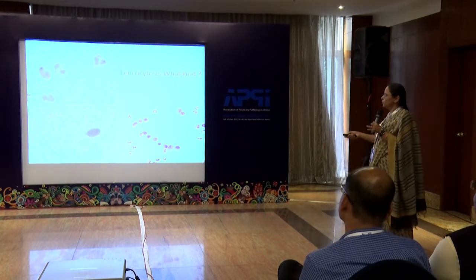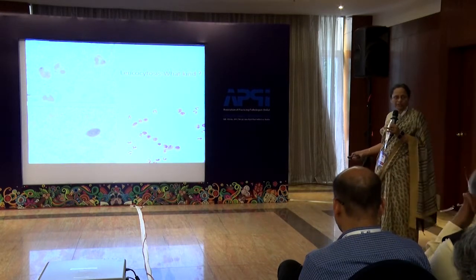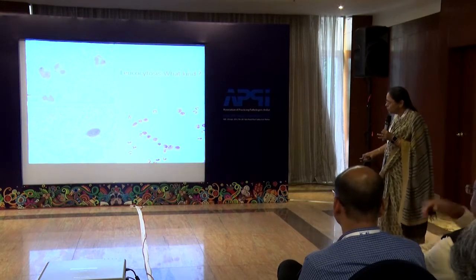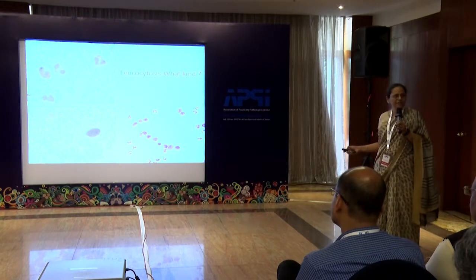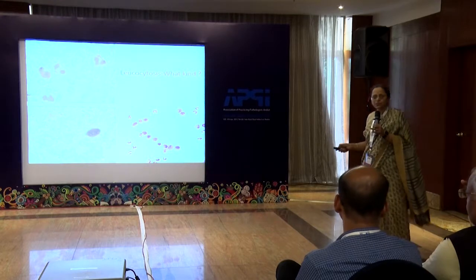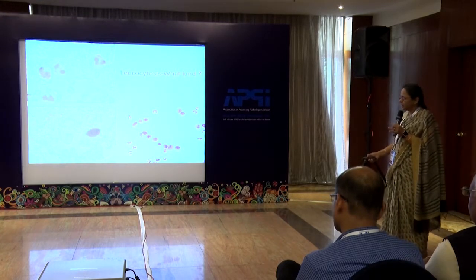This is also leukocytosis, but this is a classical field for what? If you saw this field, CML. This is leukocytosis, but a CML kind of picture. This is leukocytosis from a patient with hypereosinophilia. So if your instrument is not sensitive to these, you will miss these diagnoses. And this is a morphology. Can anybody interpret this cell?